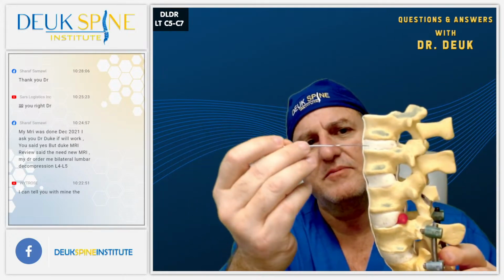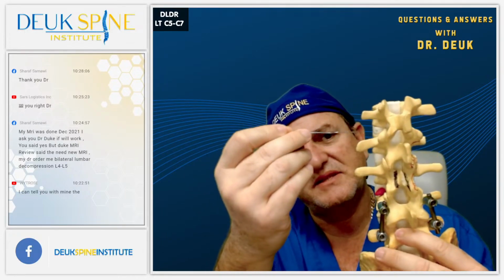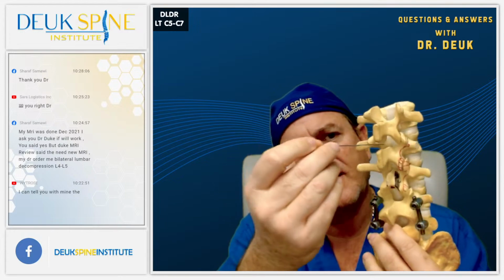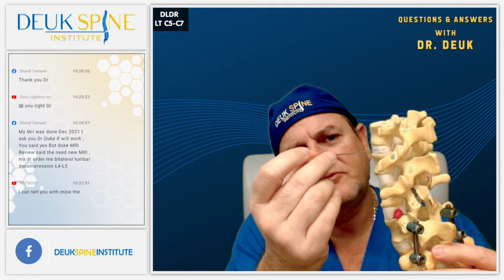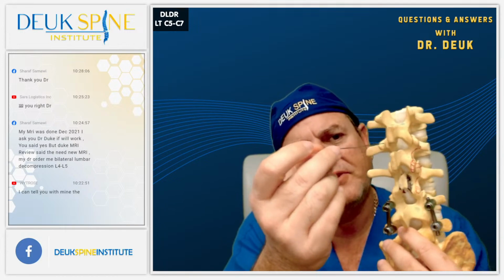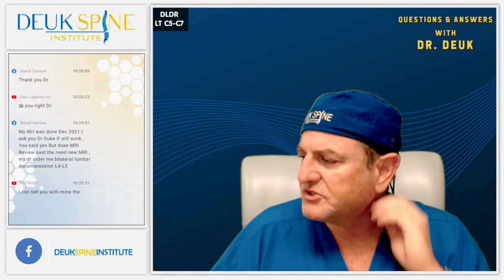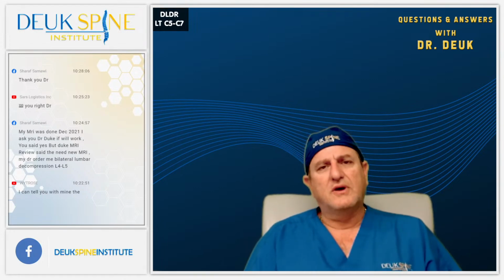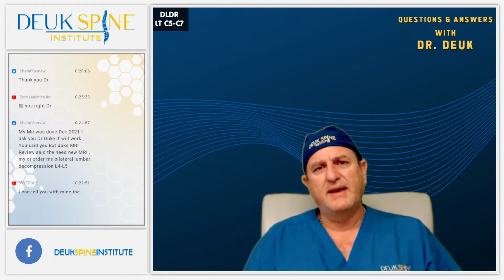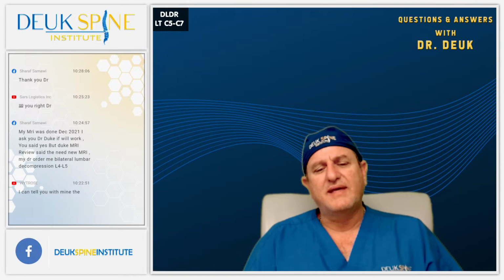this white thing here between these yellow bones, that's a disc. The facet joint is in the back, right here. You have a left and a right facet joint for every disc. 85% of back pain comes from the disc, 15% roughly comes from the facet joints. So the Deuk plasma rhizotomy is a treatment to fix facet joint arthritis pain. It's done with plasma, which is a high energy vapor, to deaden the pain nerves to the facet joints. So that will be our next surgery.